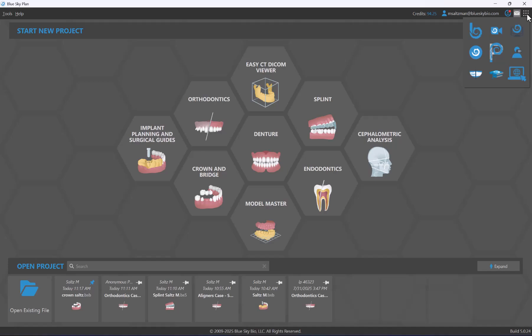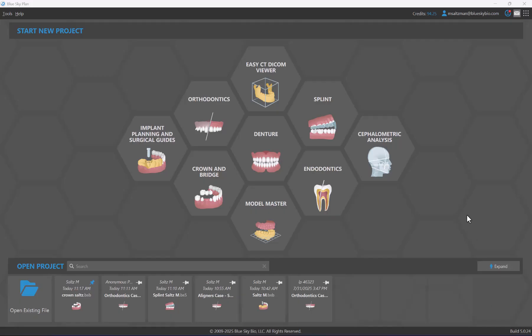To the right we have nine dots providing access to other digital solutions that complement Blue Sky Plan, including Bio Big Box for file storage or transfer, Lab Pronto to order dental lab work, Blue Sky Monitoring for remote patient aligner monitoring, and many other options. Bottom right of the screen shows the relevant software version and build number.